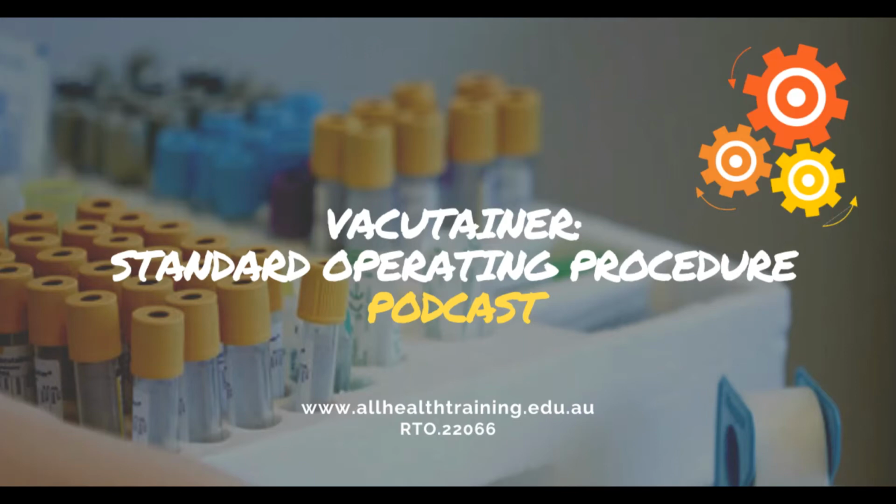Now to assemble. Take the barrel with the small hole in your non-dominant hand, ensuring you are holding the coloured end of the needle in your other hand.